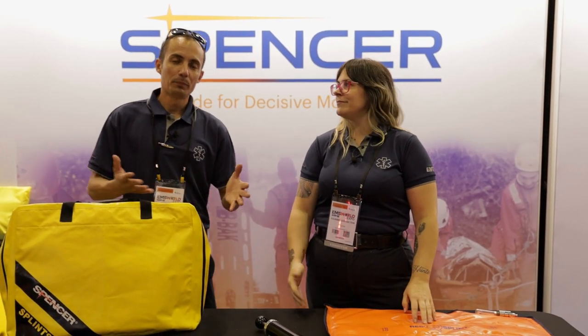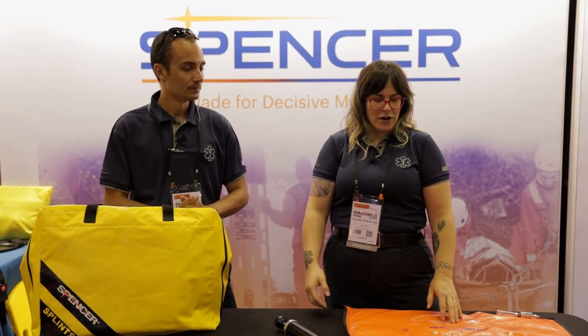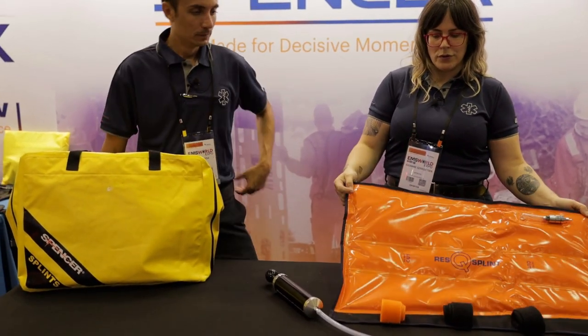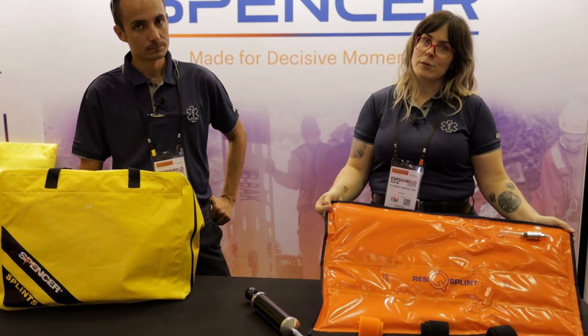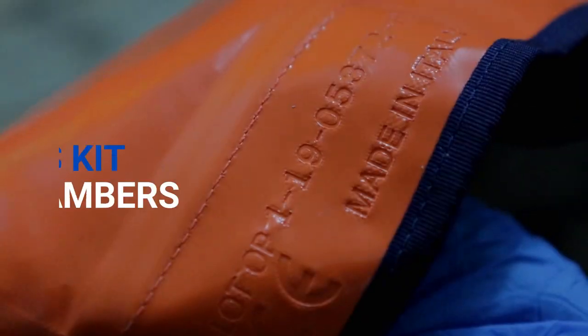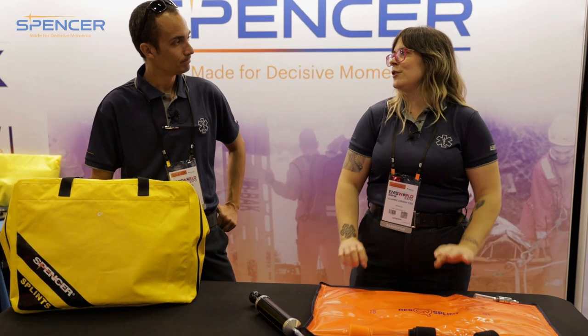Hey, I'm Julie and I'm Pete and we're at EMS World in Orlando. We are here at the Spencer kiosk and wanted to talk about one of their cool products, which is the rescue splint — a vacuum splint.